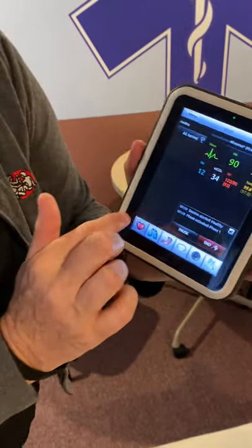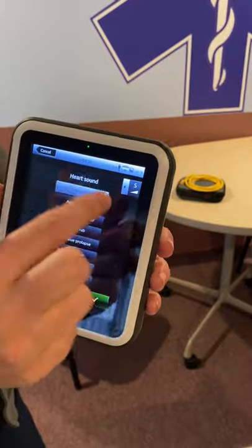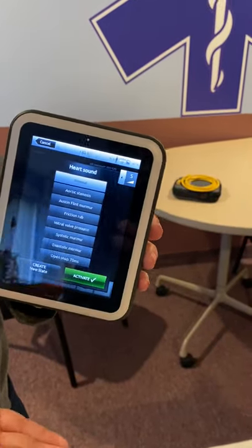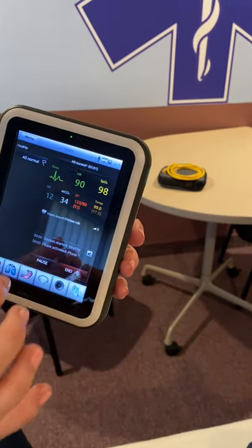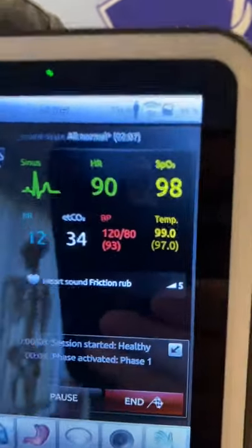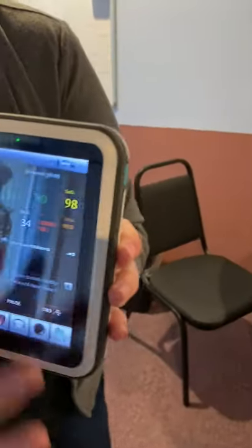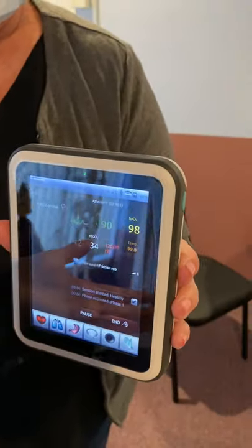Back in the heart settings, we can go through sounds. The mannequin does have pre-ported heart sounds. Think about that volume setting when your students have to listen. Here's where you can change the sound and hit Activate. It's going to show you what sound is going on with the mannequin — so if I add a friction rub, I as the instructor can see what sound is playing and know what the students are supposed to be identifying.